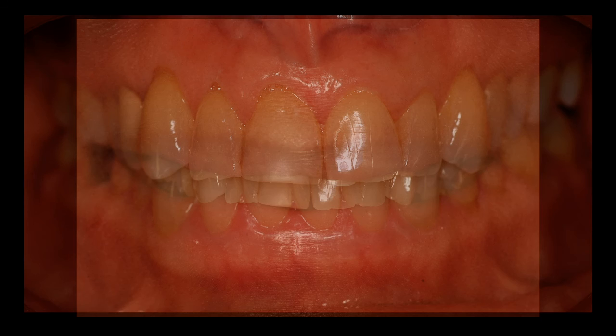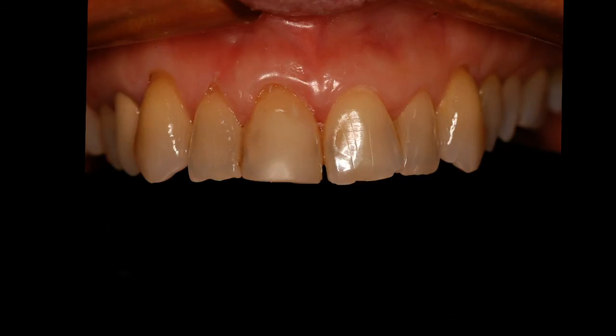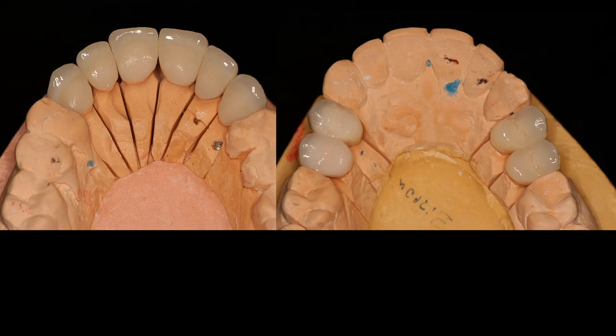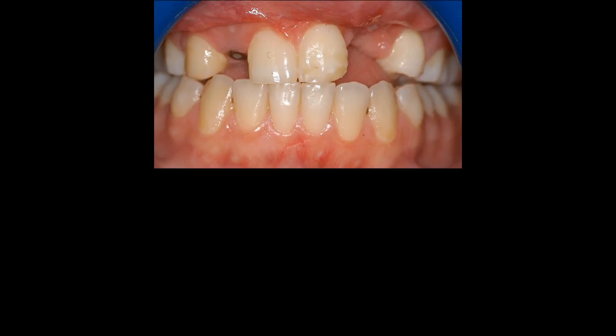When approaching situations with this type of aesthetics, with minor malposition, we could do some composites, some ceramics, and correct the aesthetics. It has to be approached properly, deciding whether a full ceramic or a veneer should be used. I'm going to give you the example of this patient who has been treated for a cleft palate with complex orthodontic and craniofacial surgery, implants, and bone grafting, and all that.